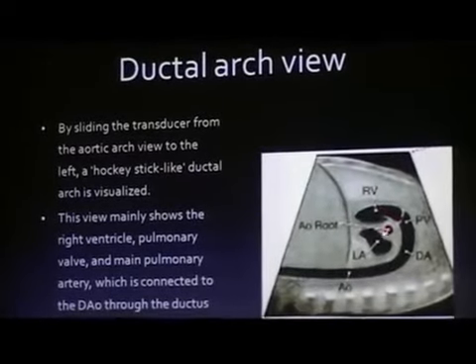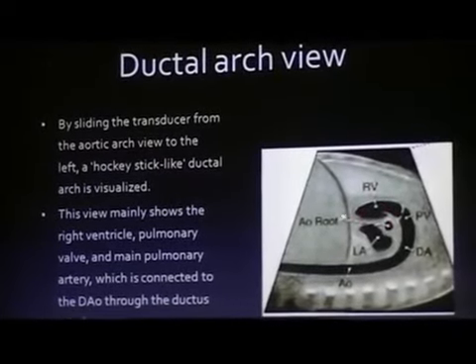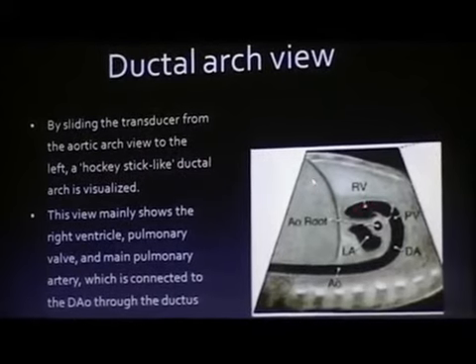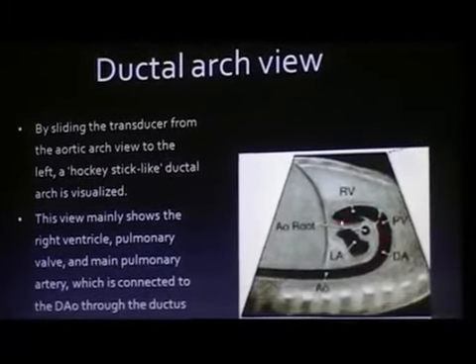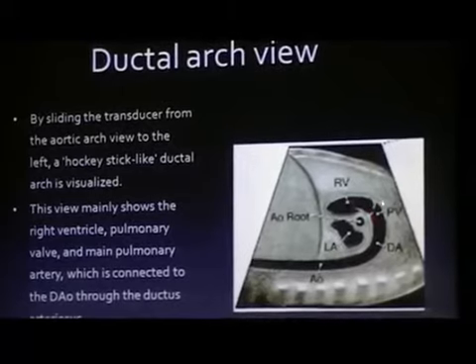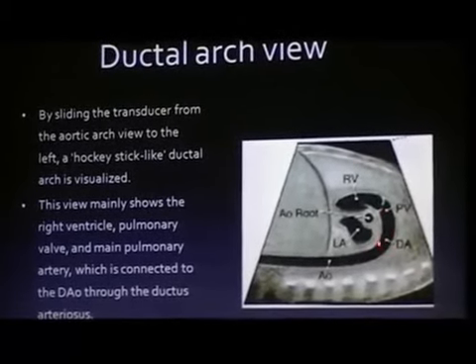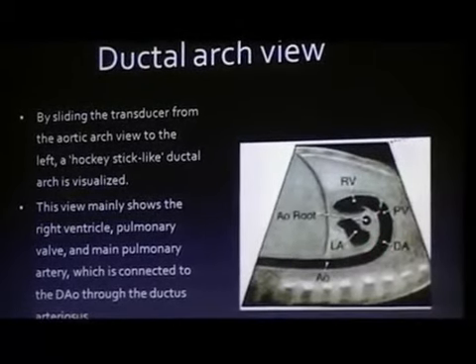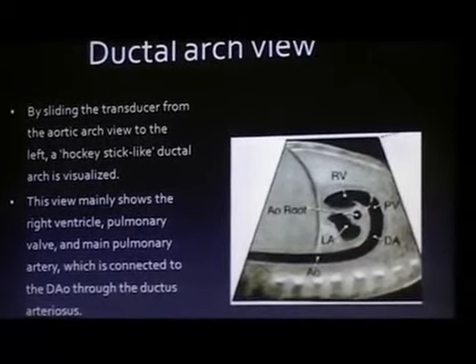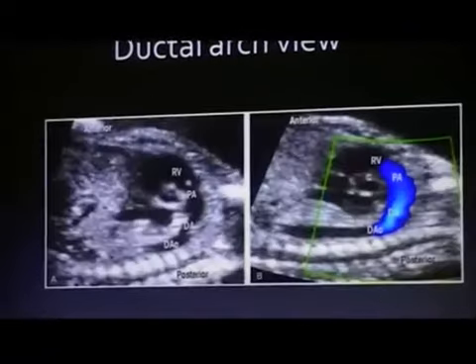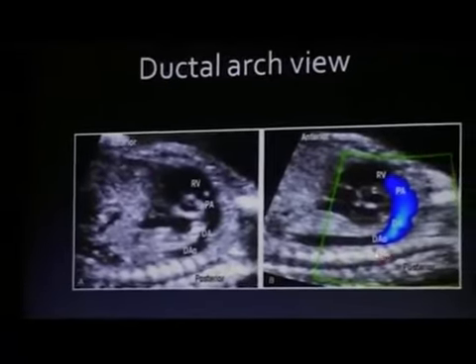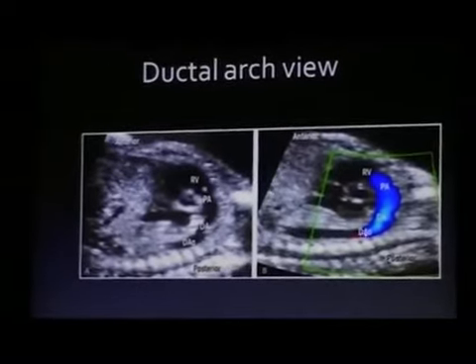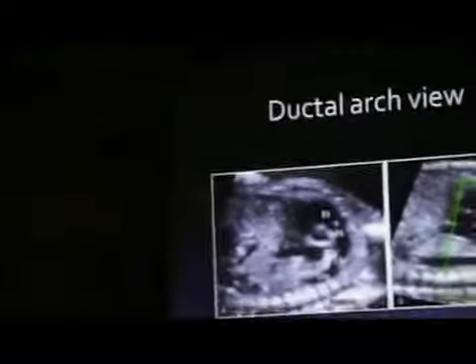This is the ductal arch view. The ductal arch view originates from the right ventricle — pulmonary trunk — and the pulmonary ductus arteriosus. The ductus arteriosus then opens and unites with the aorta. Here, the ductus arteriosus unites with the descending aorta.